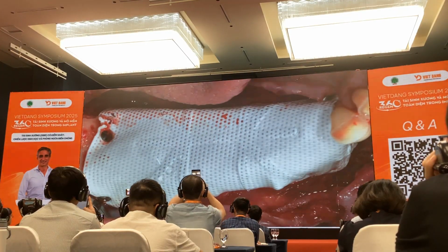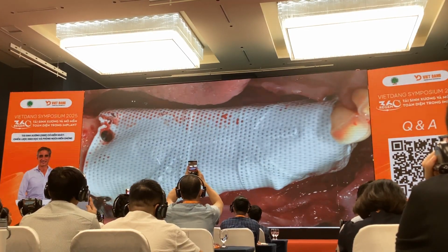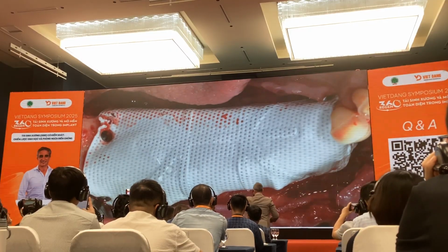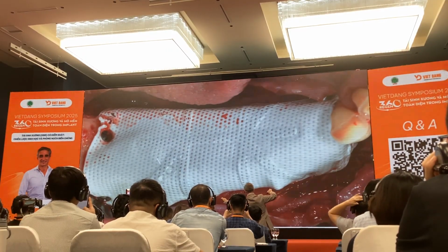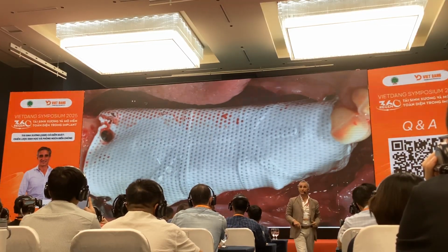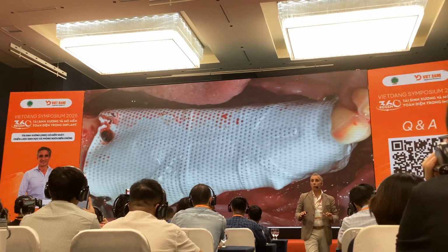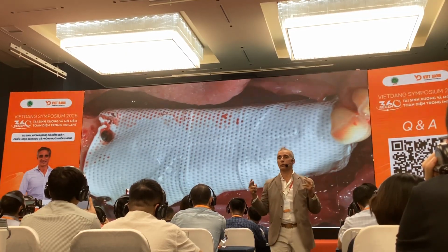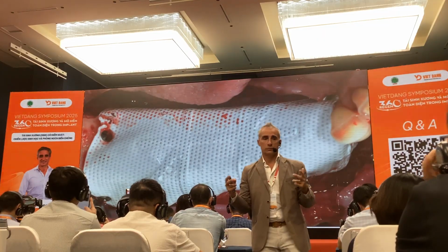And then I close the membrane over the top of the biomaterial, fixing the membrane buccally, distally, occlusally, everywhere. I don't want to have any risk of contamination from the connective tissue.